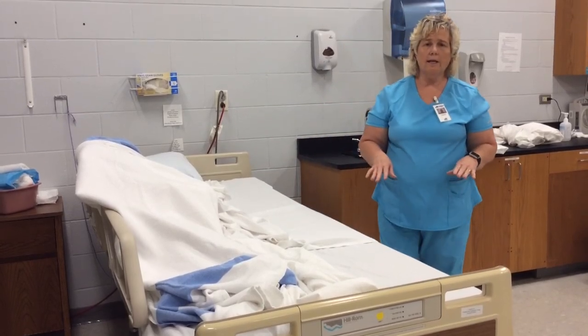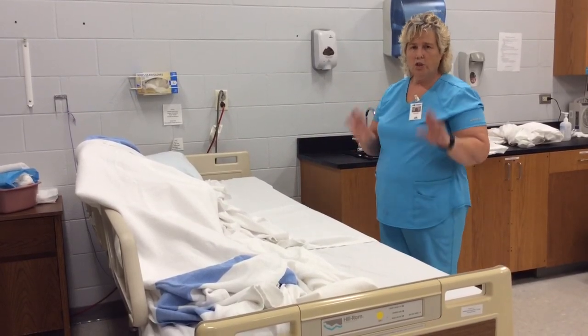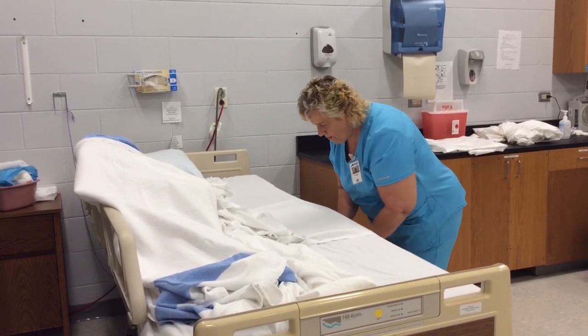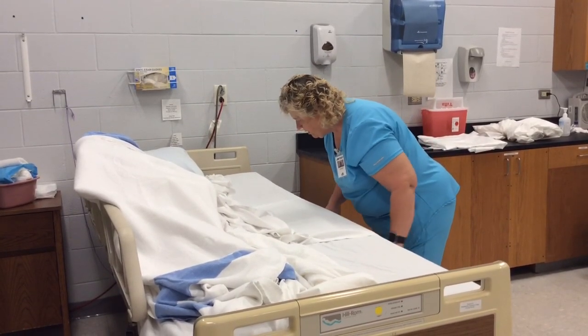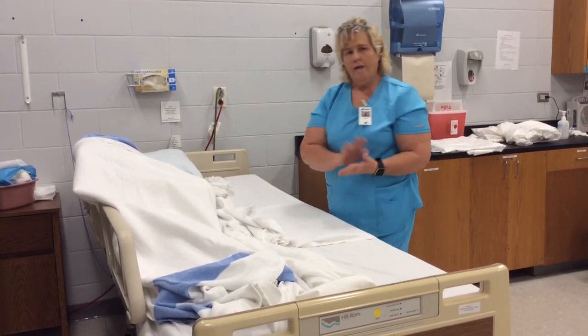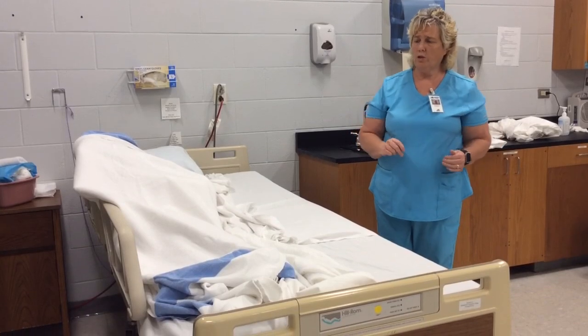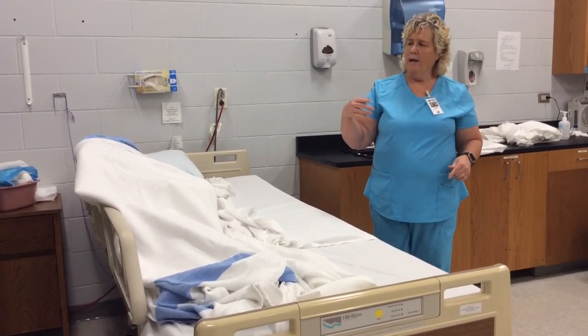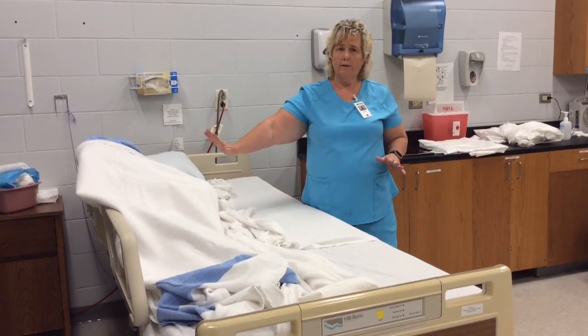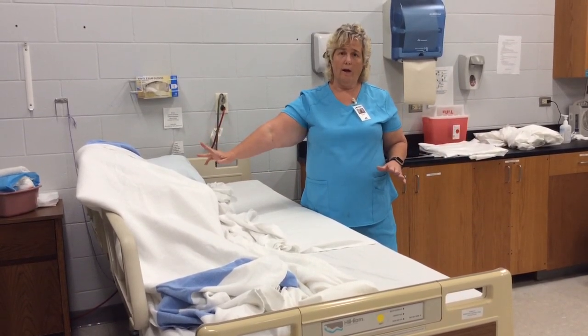Now I'm going to tuck this in, and we always tuck any of the sheets in with our palms up so that the bed frame won't cut our knuckles and get our ring caught on it. At this point in your skill book, it wants you to put the side rails up and go to the other side and put the side rail down. I am very afraid that if you do that, the mannequin will fall out.